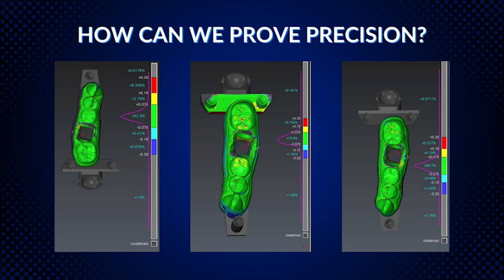Again, referencing the screen, you can see it's kind of an overlay. I have a base STL that I use, and then I scan the model that I've printed and compare the two. This particular software gives me percentages, it gives me Z ratios, it gives me all kinds of information that I like to use to validate resins. Now in the lab, you can do that by checking the resins that you're currently using to see if there are any minor changes that you need to make.